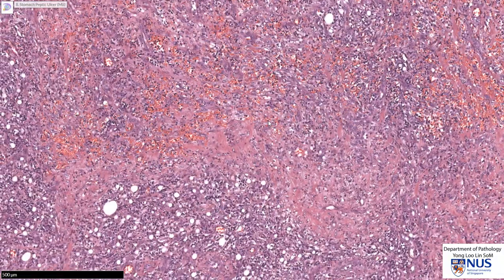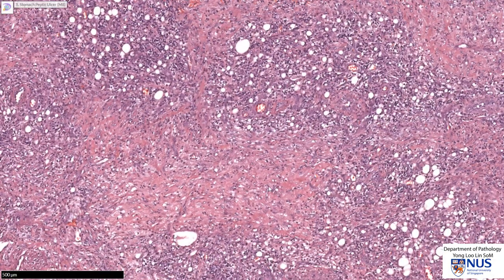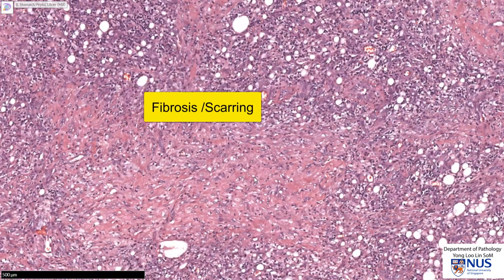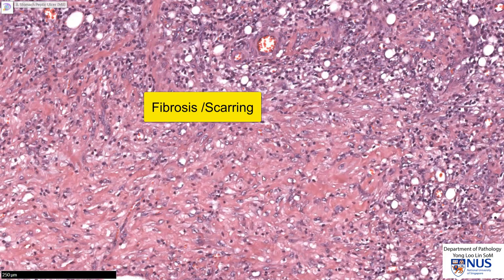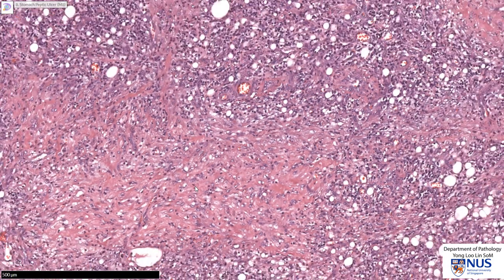And as we go deeper, we then see the final zone — the deepest zone — which is the zone of fibrosis or scarring. This appears quite pink because the fibroblasts have actually laid down collagen. And this is the region of the scar of the ulcer.